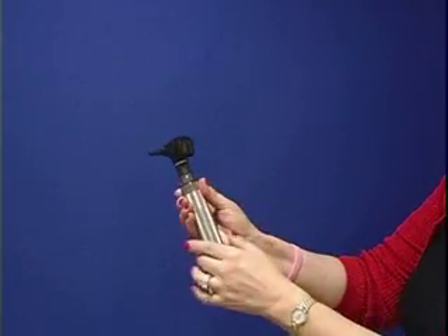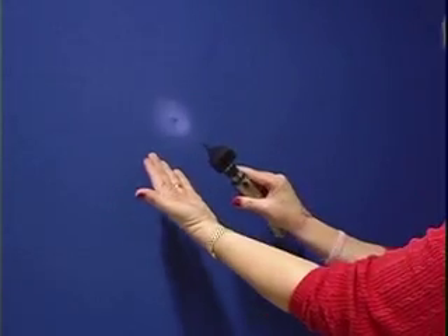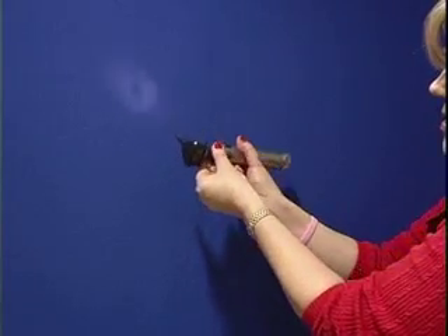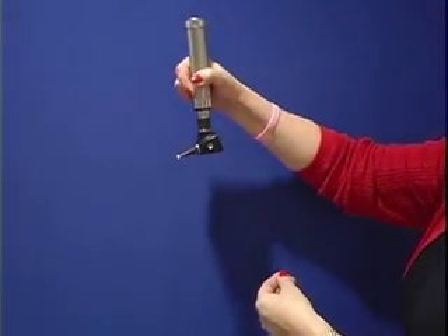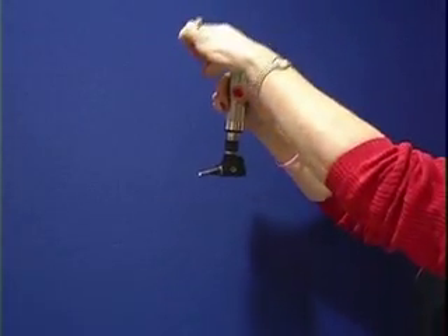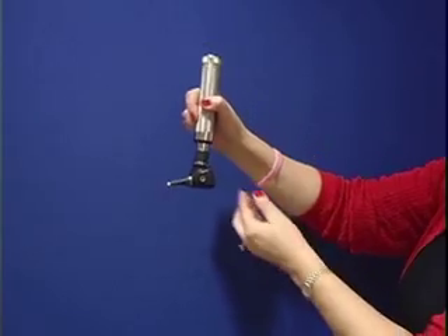It's very easy to use. You simply depress the button and turn it and the light goes on — you can see the light here. When you examine the ear, it's easiest to hold the otoscope upside down so that as you're holding the patient's ear up and back, you can manipulate the otoscope.